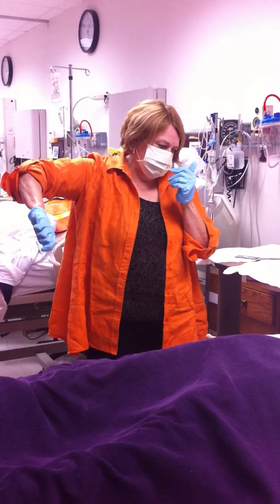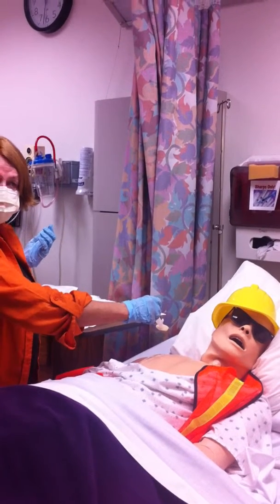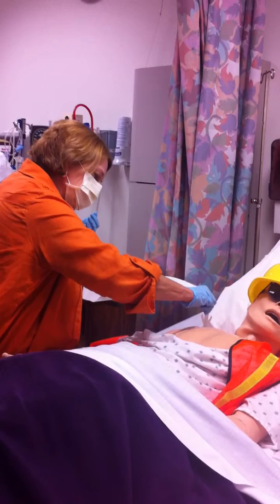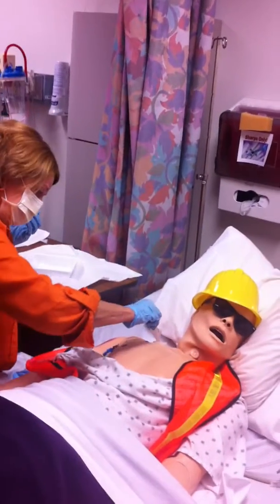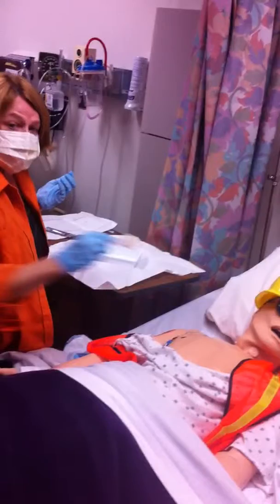If you are using chlorhexidine, best practice says that you clean an area, moving your chlorhexidine in a horizontal fashion, then moving it in a vertical fashion. So we're going to clean, and we're going to go back over and clean. That's because you can do that with chlorhexidine. Okay, now I'm going to go up and down. So horizontal and vertical. Doesn't matter which one you pick first.